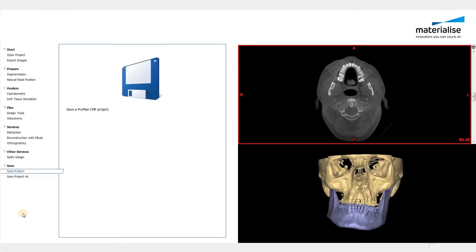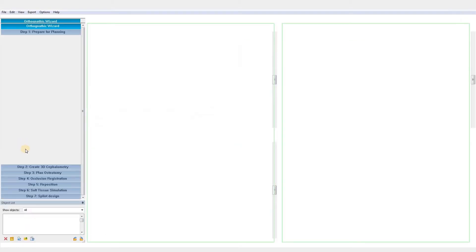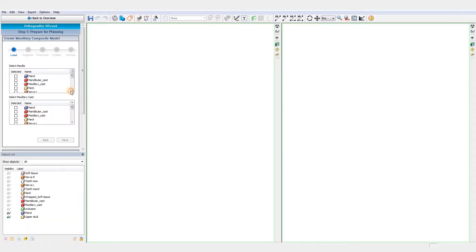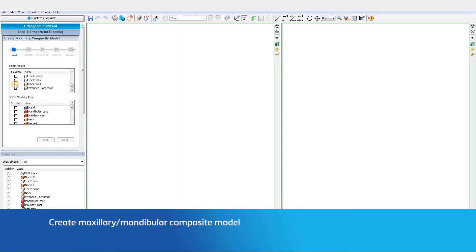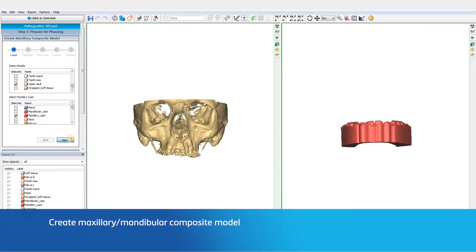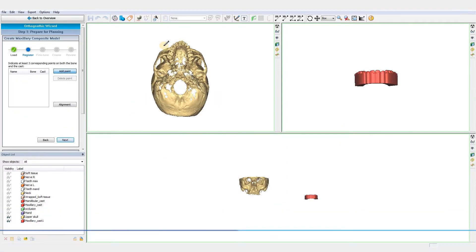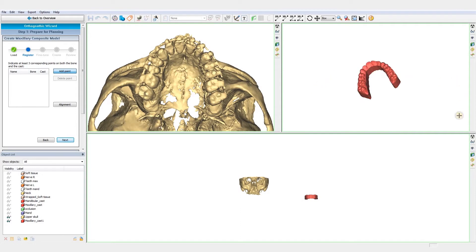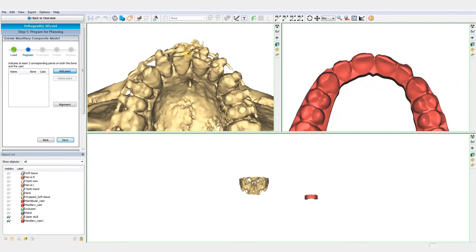Welcome to this ProPlan video. In this video we will show the five steps to follow in order to prepare your case for an orthognathic surgery planning. The first step is a preparatory step. This step involves creating a composite model. The composite model is made by combining the dental information from the casts with the bony information segmented from the CT images.